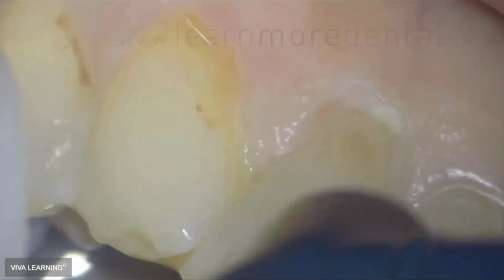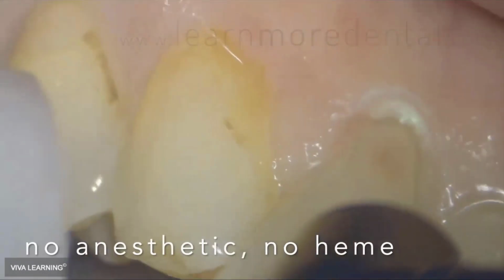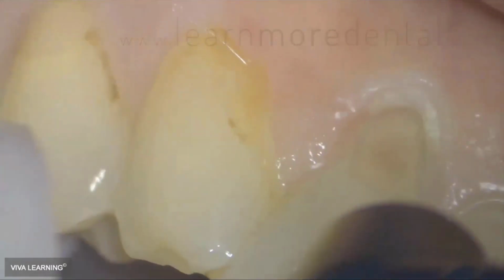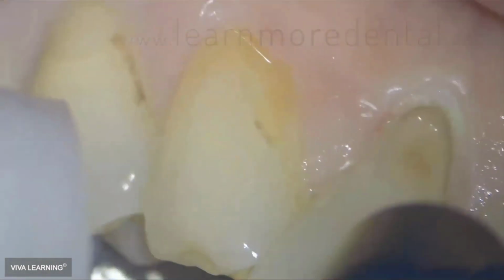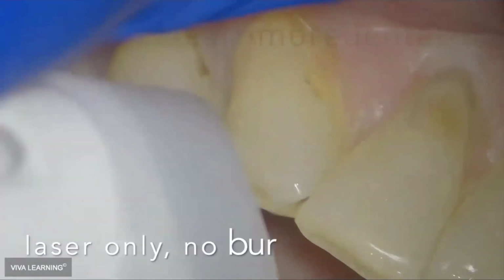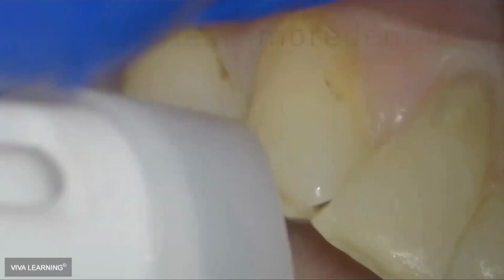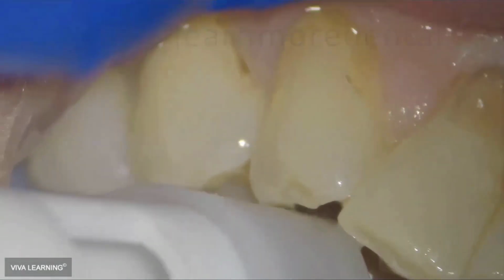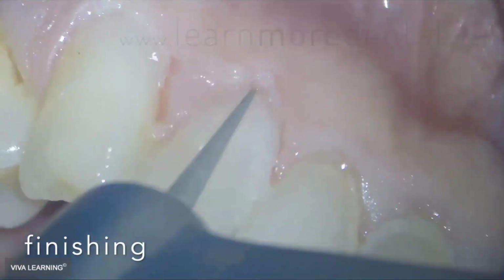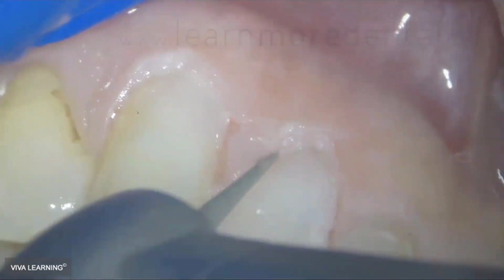This is a standard class 5 where you don't really know where the lesion is. You see that it's there, but how far does it extend apically? My preference nowadays is to remove the gum and fully visualize the lesion, have a nice outline form, and once I can establish healthy tooth structure around the whole lesion, then I just go for the middle. So this is about a 30-second prep, as you see, and the soft tissue was absolutely not a problem at all.